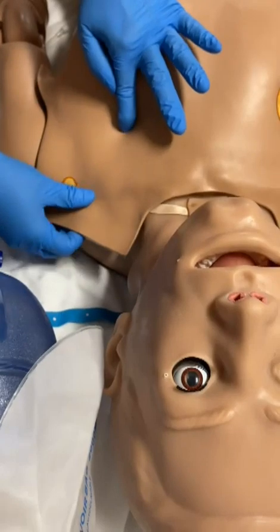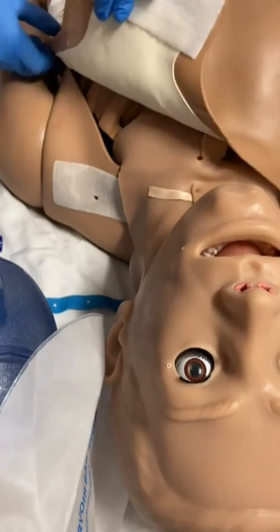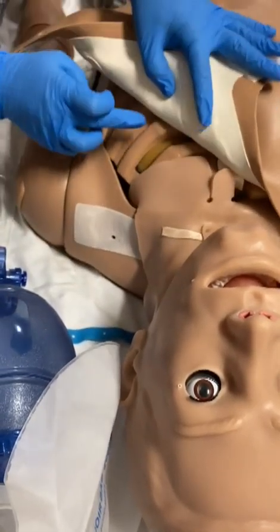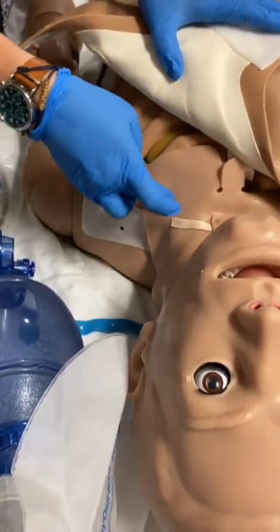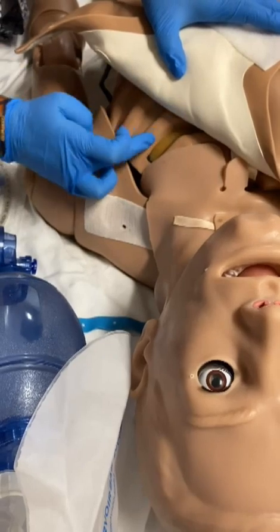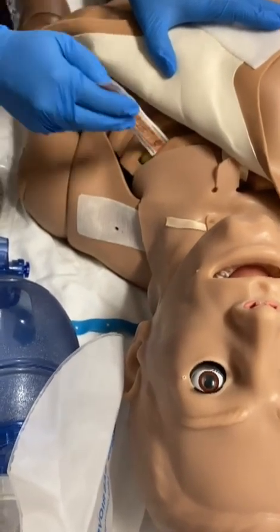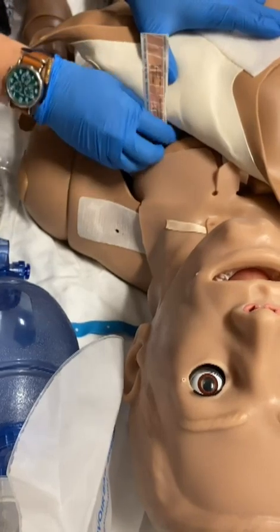So that's where we're going to go — and there we are, we're in. Going over that third rib: there are nerve bundles that run across all of these ribs. I find one first divot, second hill, second divot, third rib — nerve bundles run right around that. So I'm just going to ride that needle over that nerve bundle and then straight down. Typically with 14s — I know that's my spot — ride over the nerve bundle, straight down. You should have a whoosh of air, you pull that out, and then you secure.